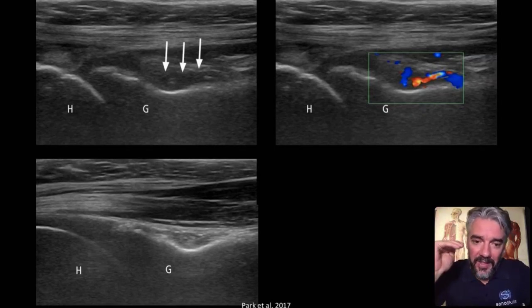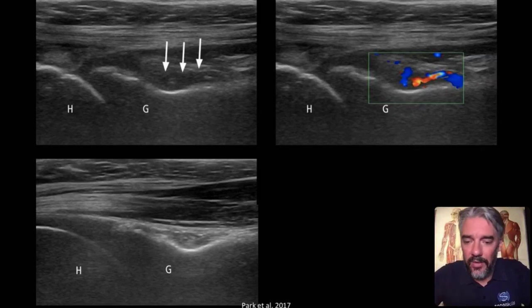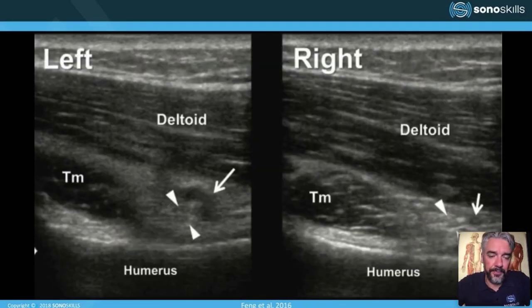But does it stay dark, this vein or this anechoic zone? Although you are externally, internally rotating, in that case, it's pathology, and most likely it's a cyst near the suprascapular nerve, and it wasn't a vein. It could look like this. This is a cyst, and in this case, what they do is aspirate, and then suddenly you also see this release of pressure on the suprascapular nerve in the right image.